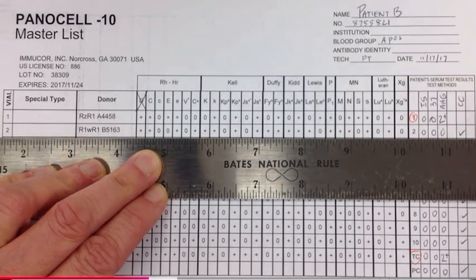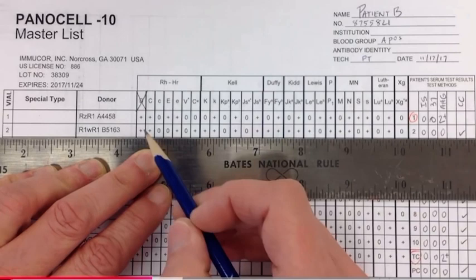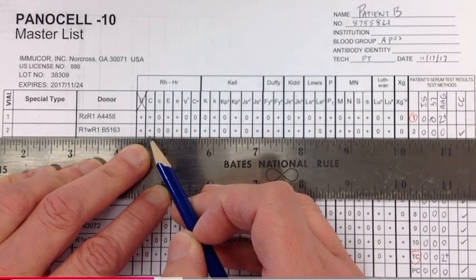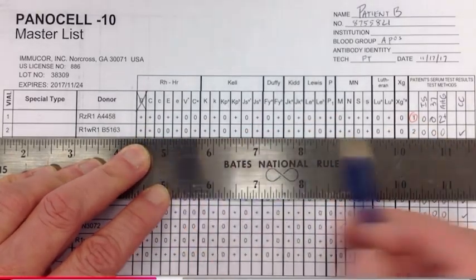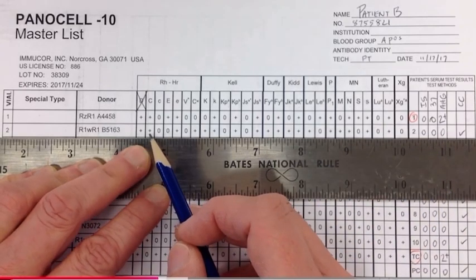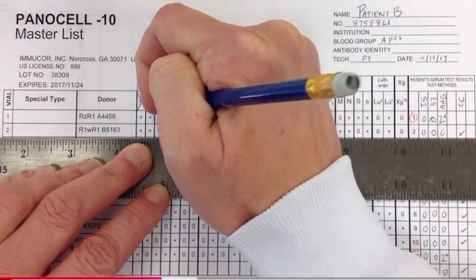But in my laboratory, we're going to take a little bit more conservative approach, and anytime we have a pair, we're going to take dosage into consideration. Okay, so big C here is homozygous, meaning that it's by itself, meaning that that antigen is going to show a strong expression. And since there's no reaction over here, it's completely negative, we can pretty confidently say that that big C is not there. So it's a homozygous rule out, so I'm going to give it an X.